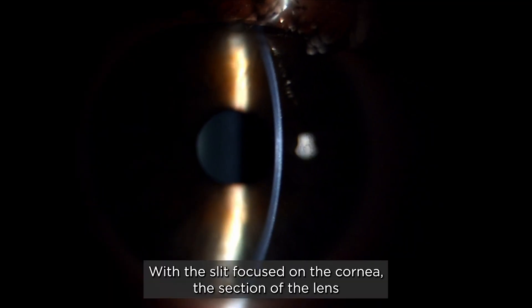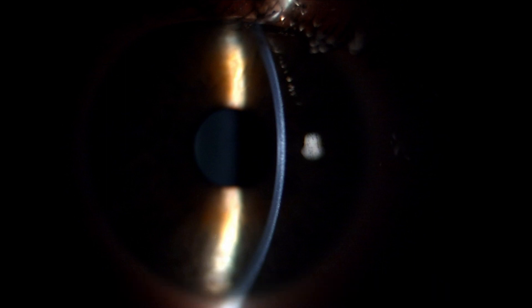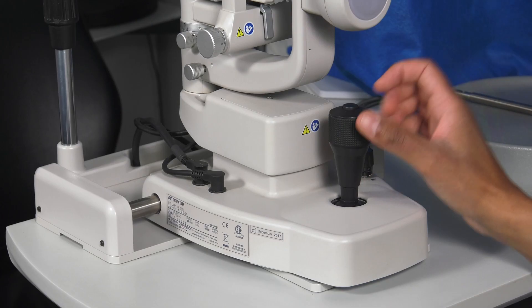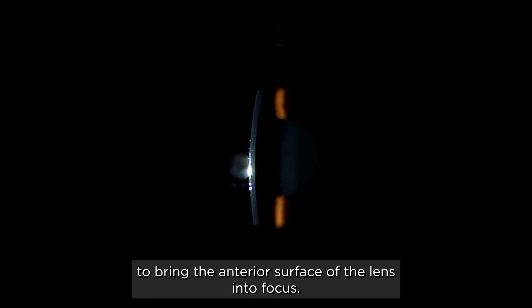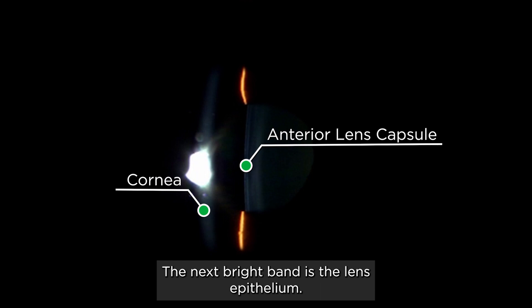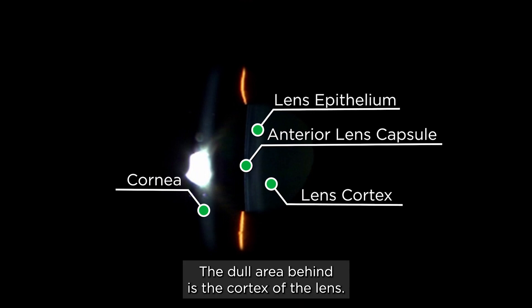With the slit focused on the cornea, the section of the lens visible through the pupil will be out of focus. It can help to reduce the slit height so the beam fits through the pupil and doesn't cause glare. Use the joystick to move the slit lamp forward to bring the anterior surface of the lens into focus. With the light beam coming from the left, the anterior capsule is seen as the bright band on the left of the cross-section. The next bright band is the lens epithelium, and the dull area behind is the cortex of the lens.